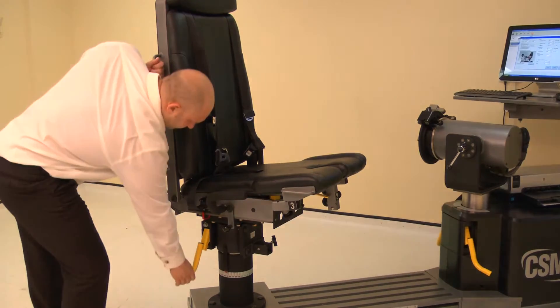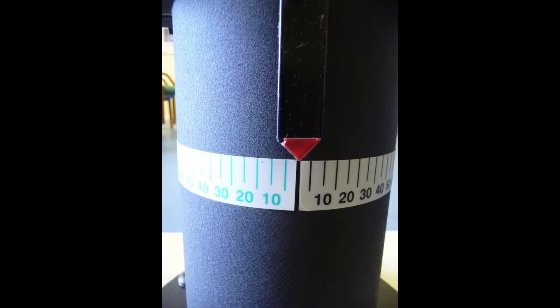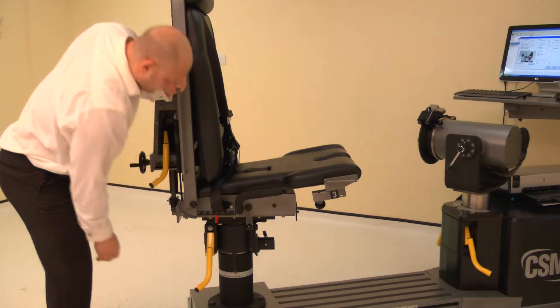Now adjust the chair rotation. Lift the locking handle and rotate the chair. Rotate the chair to zero degrees. Ensure both locking handles are pushed down to secure.